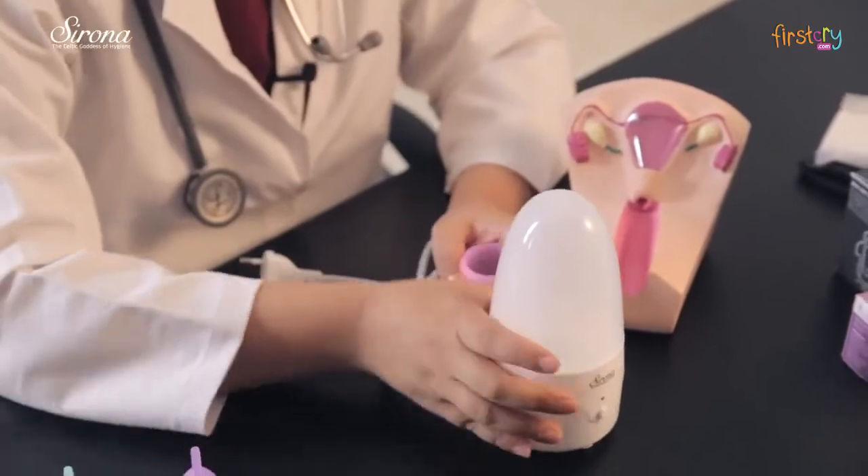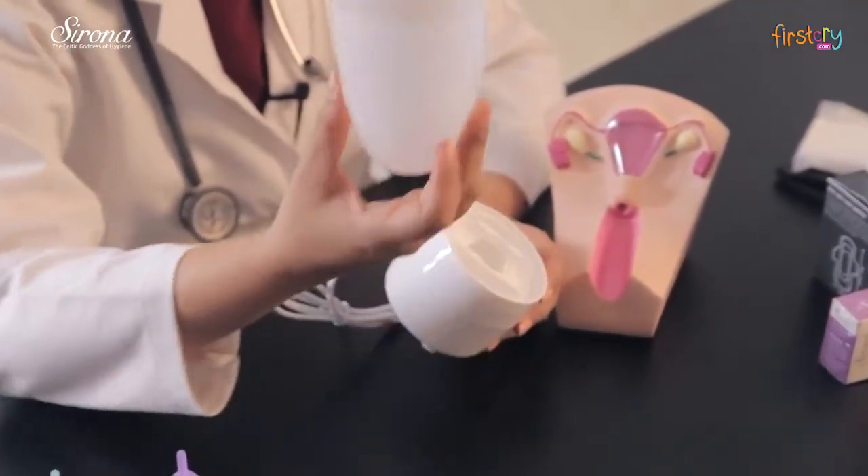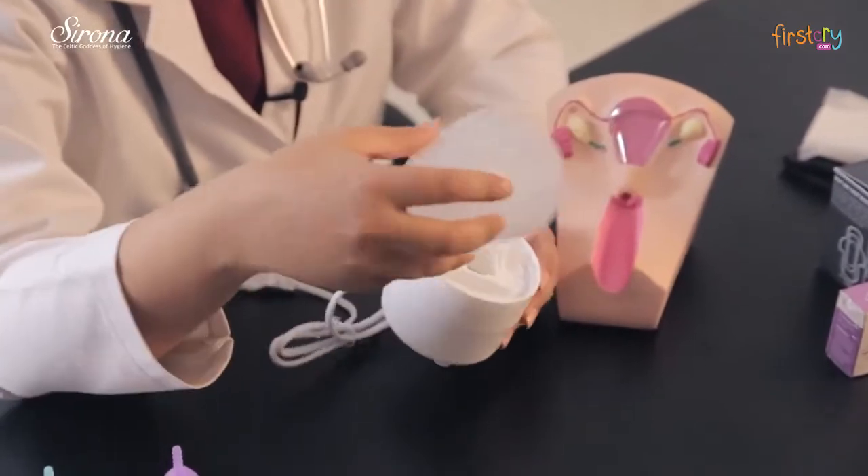The correct way to use this cup is to sterilize it in between the periods, and you can do that either by boiling it in water or you can use a sterilizer like this. So you simply open the sterilizer, put in water as per the mark on the lid, and introduce the water into this pit.